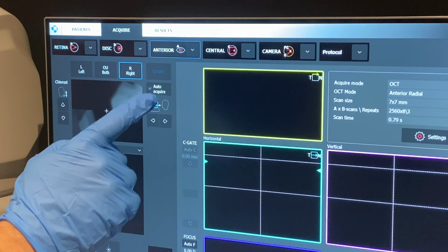And the profile map at the bottom, it's got a traffic light system. This one or this one? Right at the bottom. Here, sorry, this one. Oh, that's the normative database. Yeah. So the green bar is the normative database. The black line is the patient, in this case me. I happen to fall within the normative database, so my values are green. But you can be a long way outside normative database, but perfectly healthy. No, I understand.